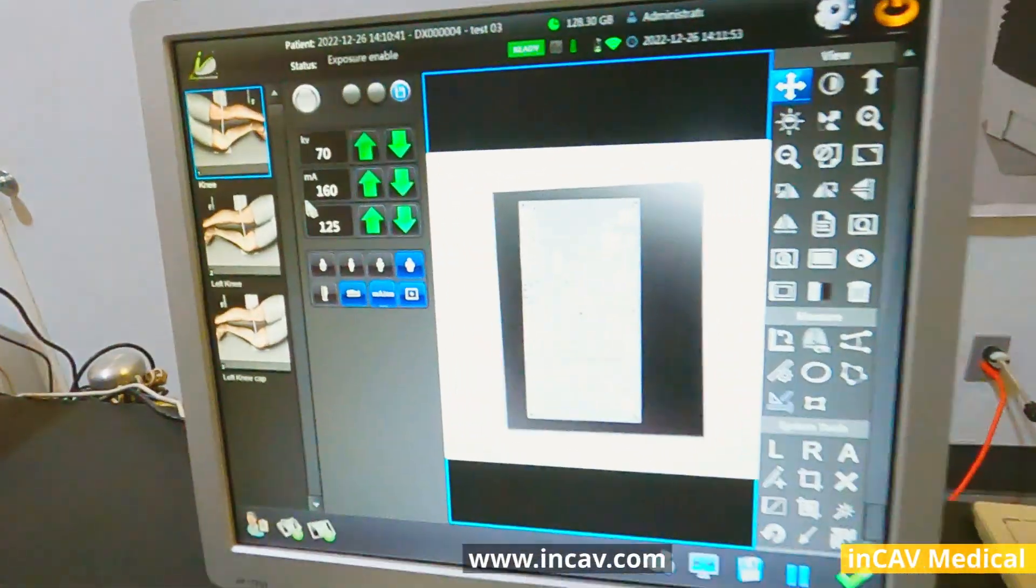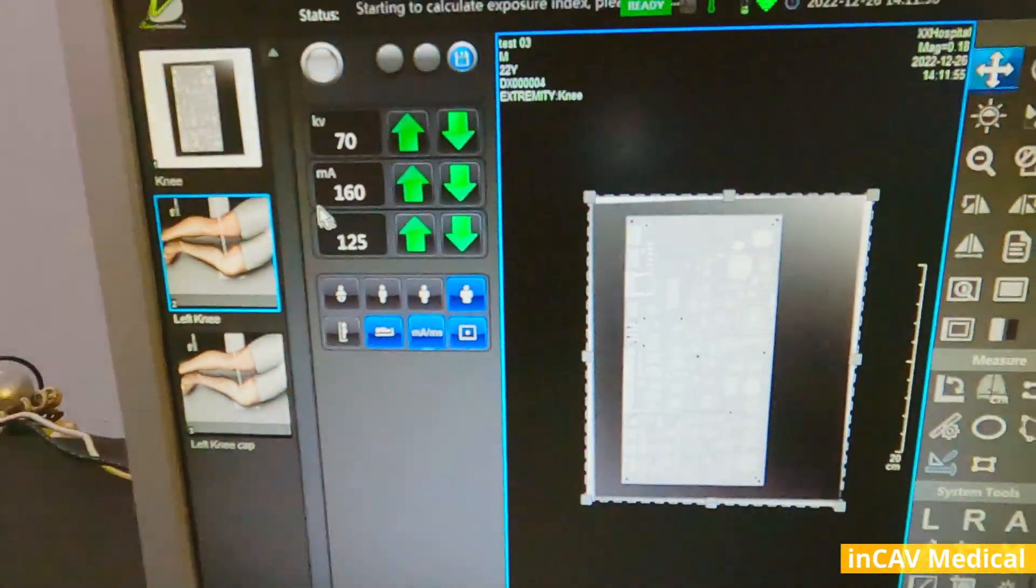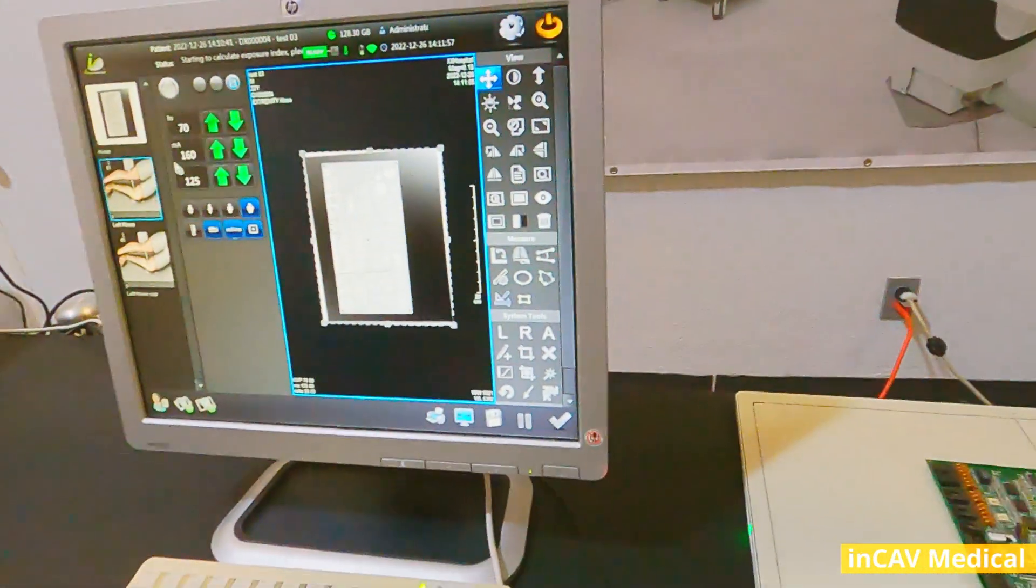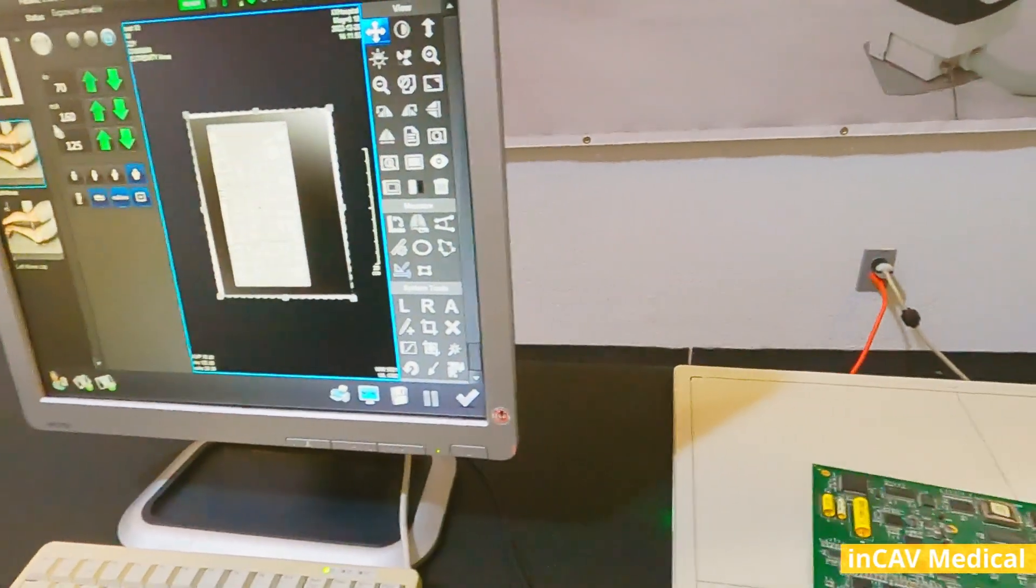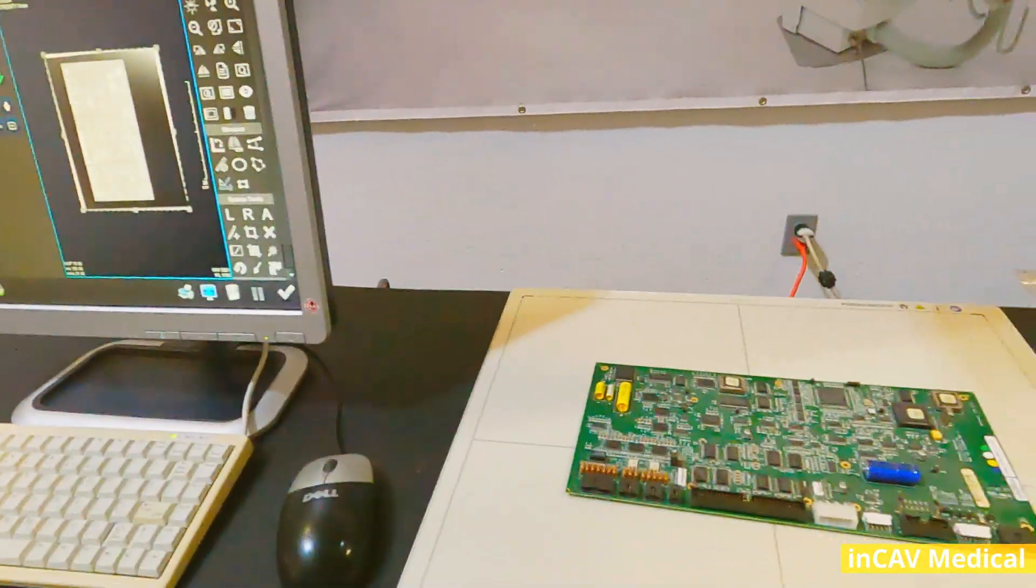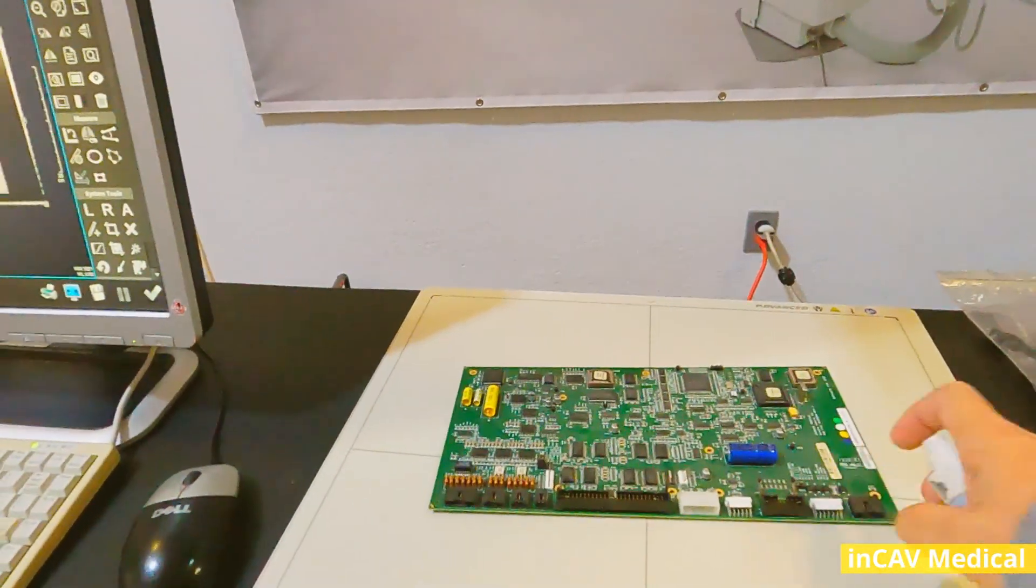It will take about one or two seconds for the workstation to show the x-ray. As you can see, this is a high-quality and high-resolution image.